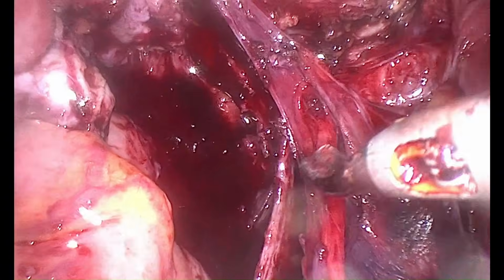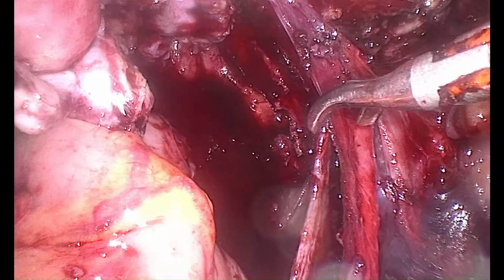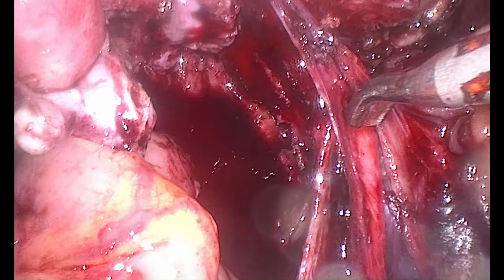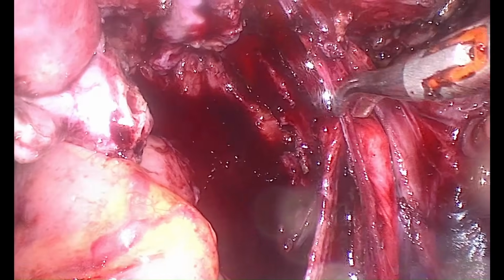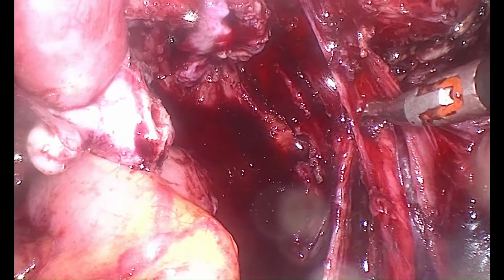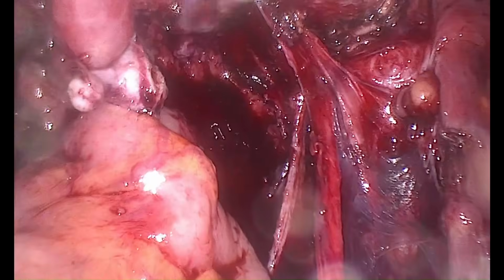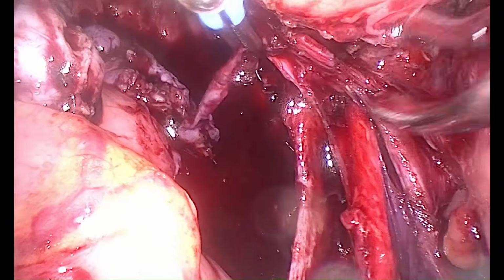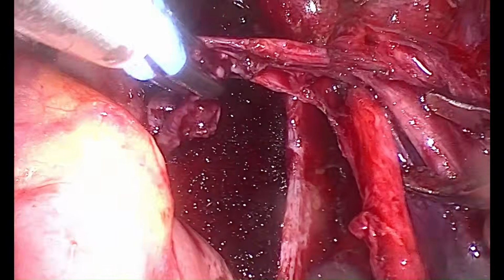This bridge is made by the uterine artery, but now we have come to know, with the advent of the 3D camera system and the robotic, that there is a deep uterine vein which goes below the ureter, and this usually bleeds in a radical hysterectomy or the endometriotic approach. So this is where we do a dissection of the ureter. You can see the ureter which is kinked now.